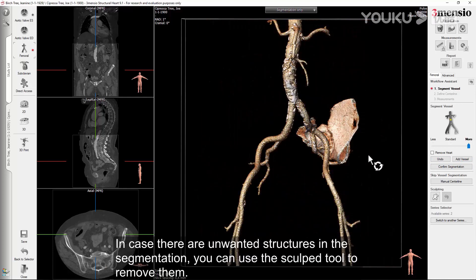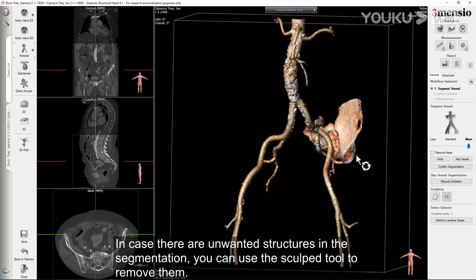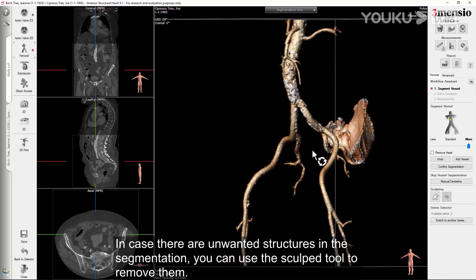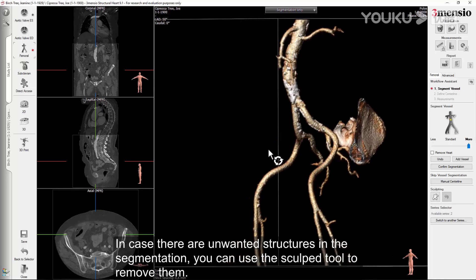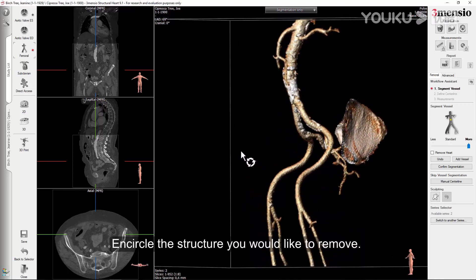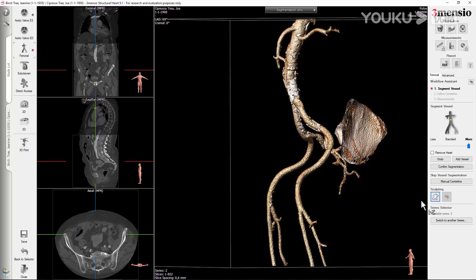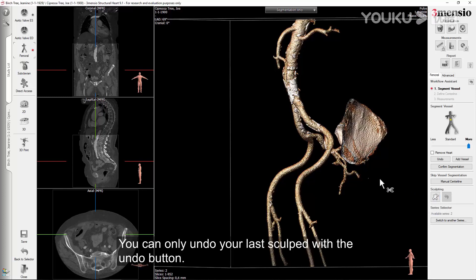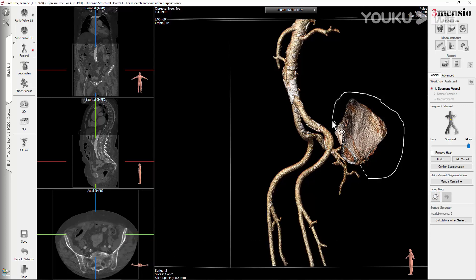In case there are unwanted structures in the segmentation, you can use the sculpt tool to remove them. Encircle the structure you would like to remove. You can only undo your last sculpt with the undo button.